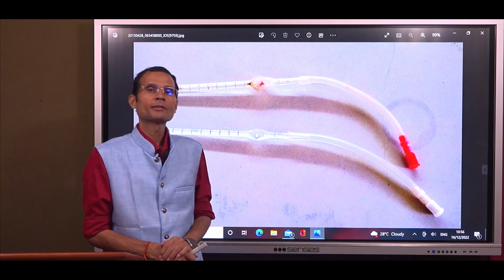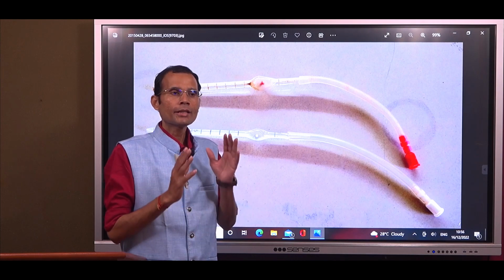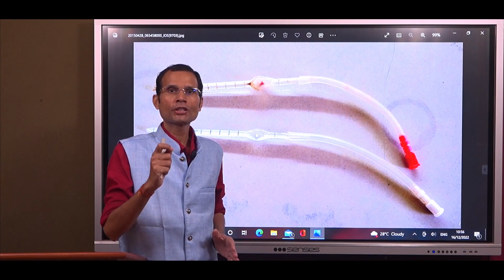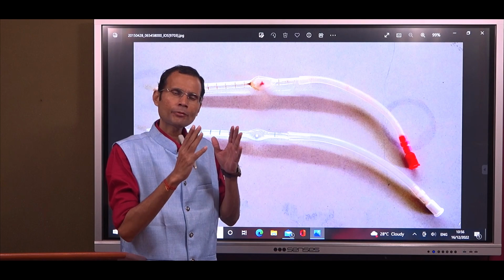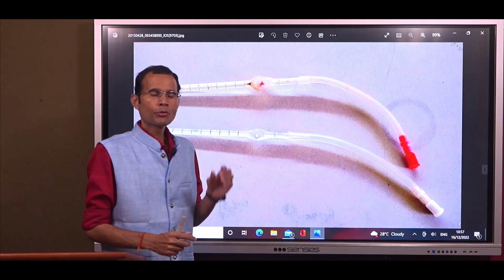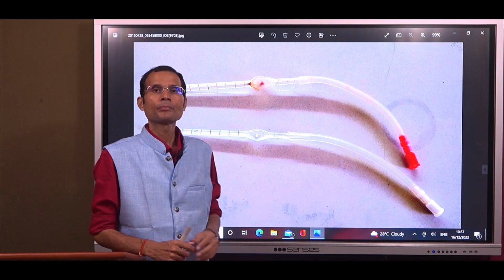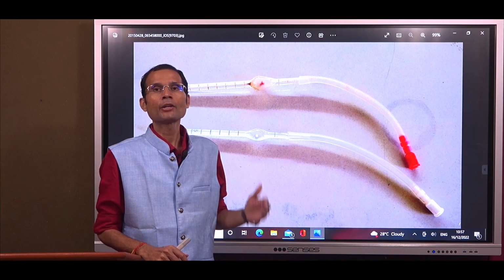Hello dear students, this is a video on practical hematology and it deals with the dilution of blood samples. This is a very narrow scope that I have chosen for this particular video. So we will see the dilution of blood sample, diluting pipettes, dilution factor and diluting fluid.